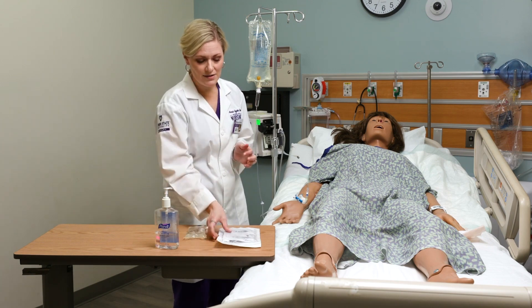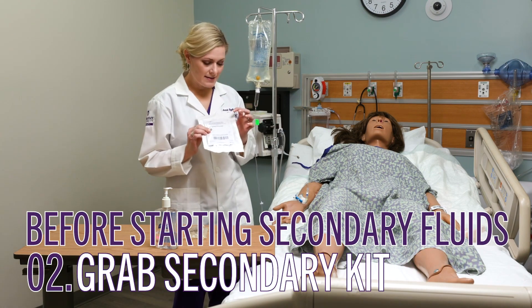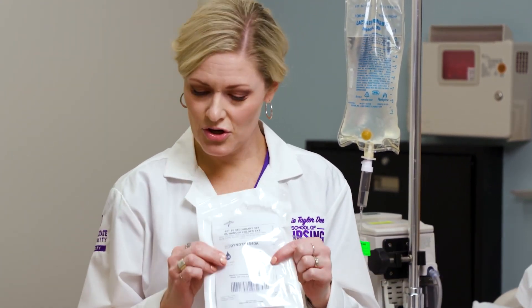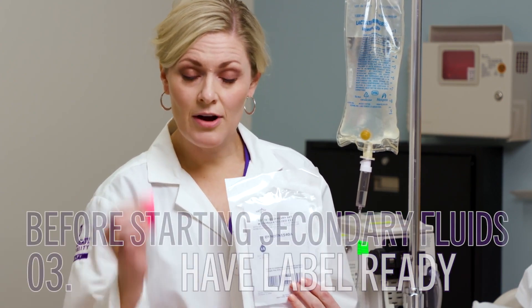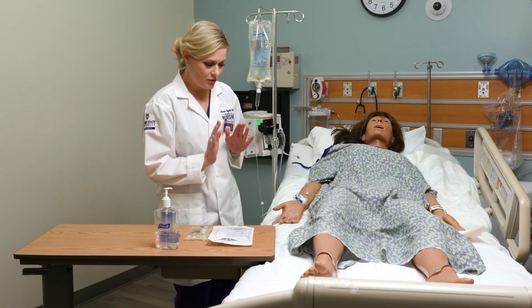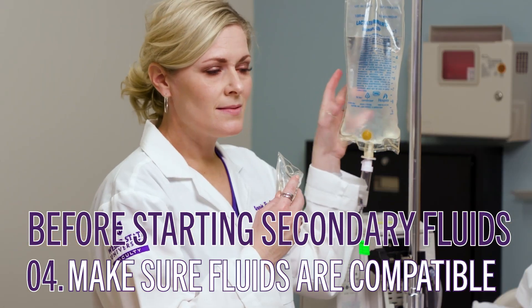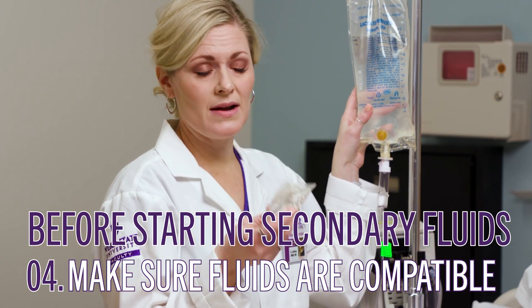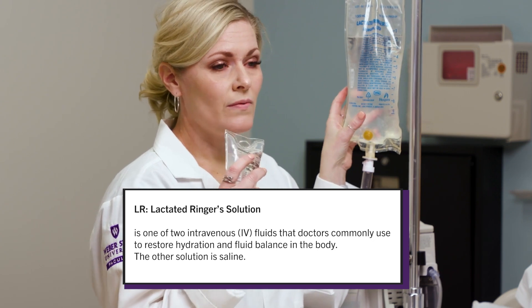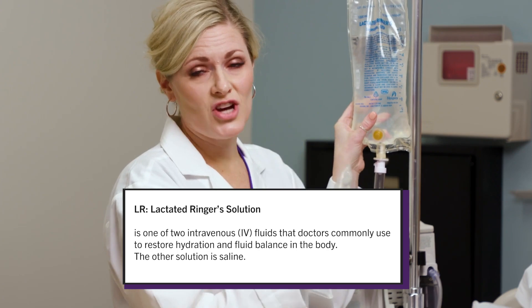I'm going to grab a secondary set, which is a little different than our primary set. It has much shorter tubing and also has a hook that I'll show you how to use. I'm also going to grab the label for how often this tubing needs to be changed. One important thing: if my patient has fluids running, I have to make sure they are compatible. Sometimes the fluid running is not compatible with the medication I'm going to give — some things need LR, some need saline. That is a critical check that can cause harm if we don't verify compatibility.